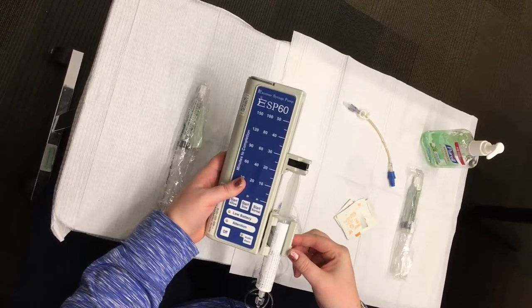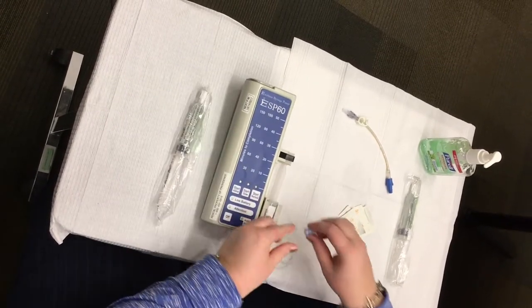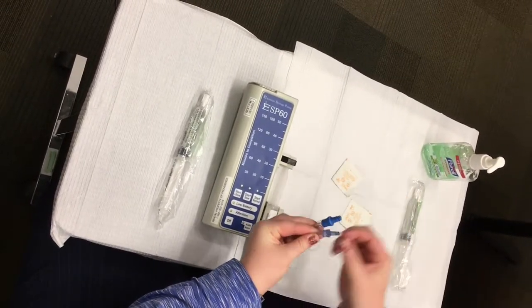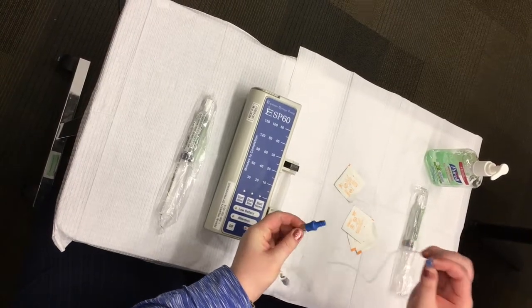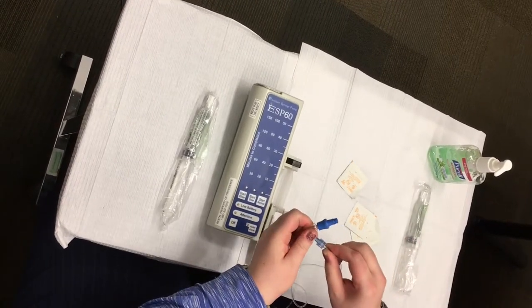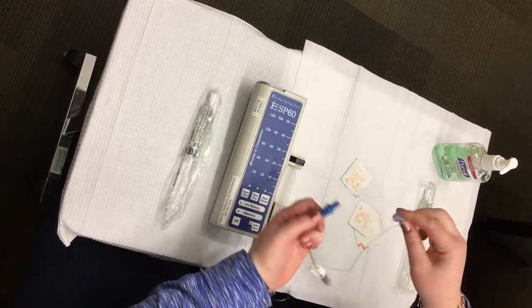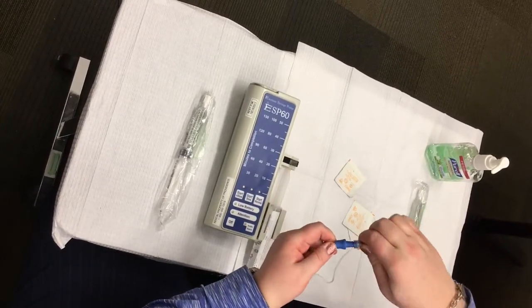After cleaning and flushing the IV line as you have been directed, you are now ready to connect the primed IV medication tubing to yourself or your family member's IV access line. Open the slide clamp to start the infusion by pressing the start normal button.